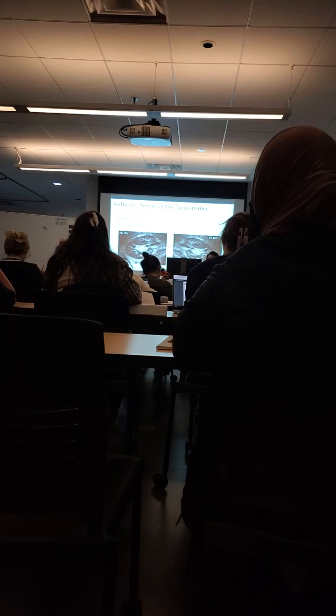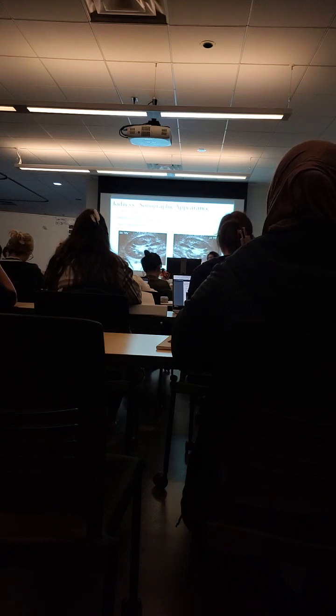But I just wanted to show you guys what it looks like. Can you see that this is a pyramid here? This is a pyramid. This is a pyramid. This is fluid because it's blood. And see how echogenic or hyperechoic the sinus is compared to the hypoechoic cortex.